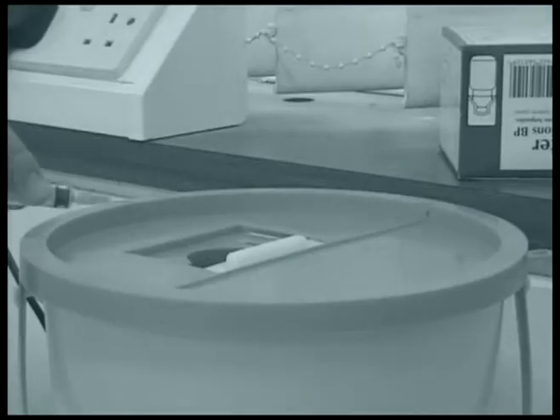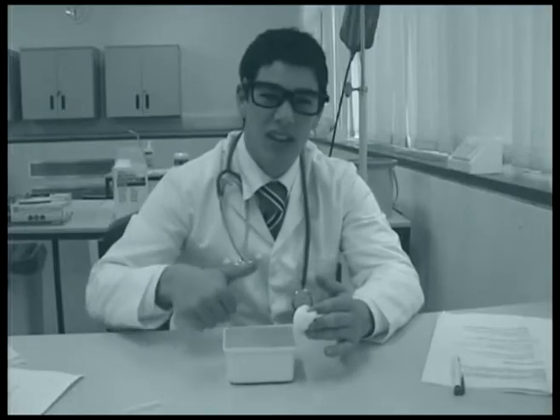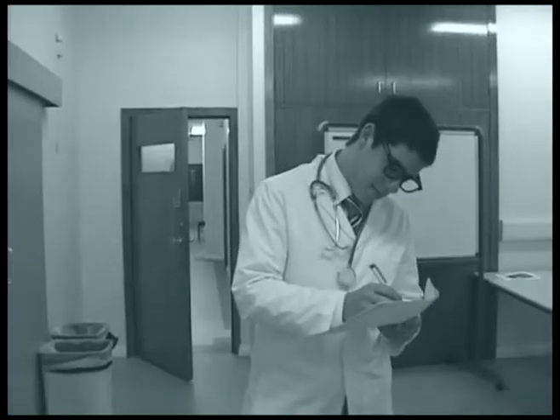Dispose of waste appropriately. Ensure the patient is comfortable. Wash your hands. Record the procedure in the patient's notes.